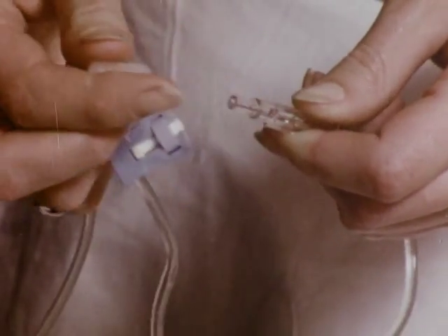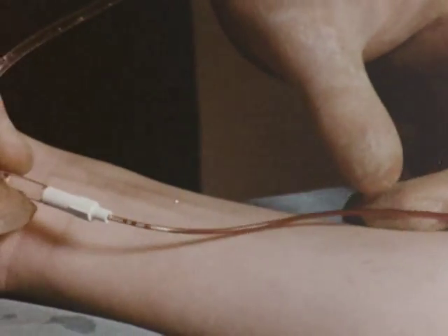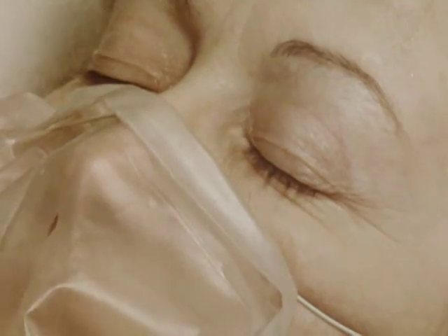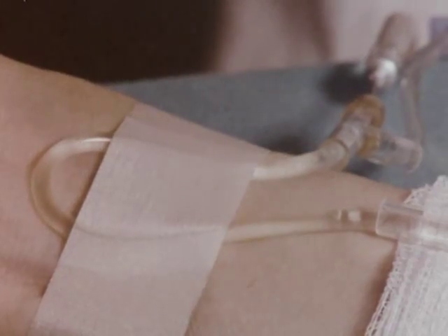Readings of CVP are taken in relation to a reference point on the patient's body, such as the mid-axillary line. Should the patient be moved, the manometer must be realigned. It's wise to measure the length of any needle outside catheter after it's been withdrawn from the vein, to ensure that embolism of the tubing has not occurred. If the catheter has been placed correctly, the fluid level will show a rise and fall with respiration, and there may also be a faster oscillation due to the heart's action.